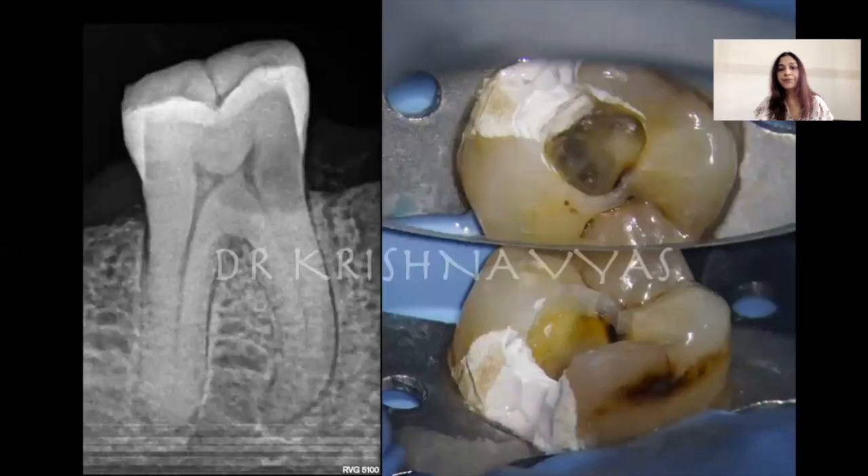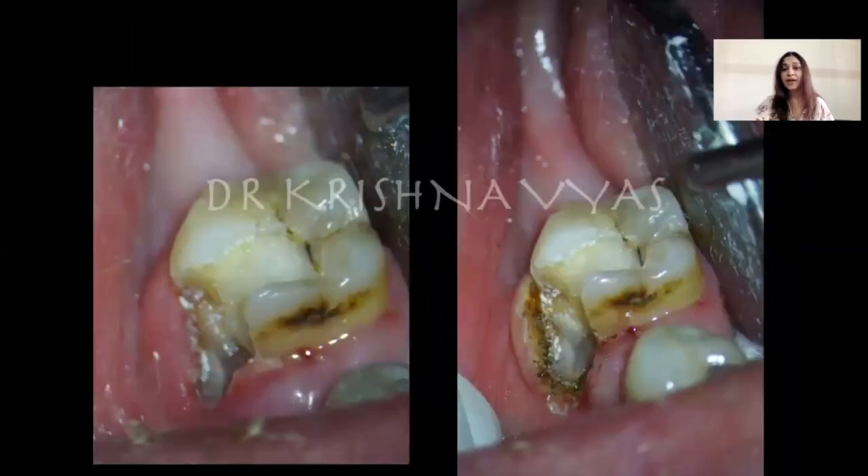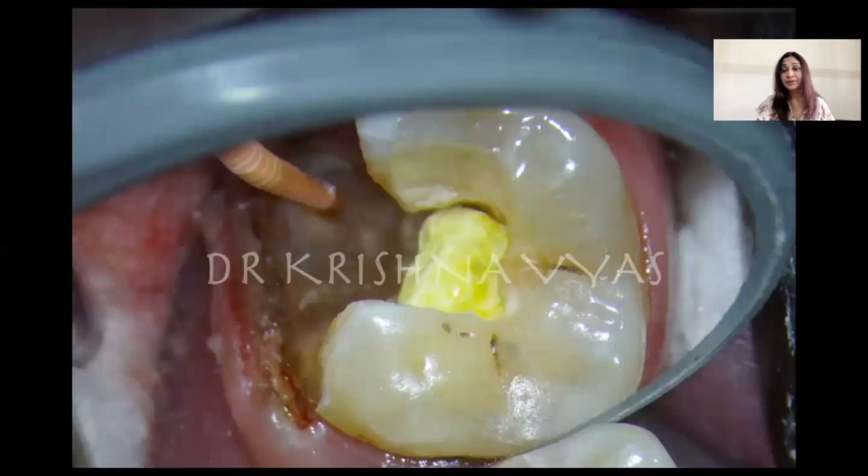Coming to the second scenario — very common in clinical practice — a Class V cavity extending subgingival with root caries. The patient had already lost two molars and did not want extraction. I did caries excavation and a quick temporary restoration, suspecting something unusual. After isolation, I could not trace the MB canal, so I removed the isolation and temporary cement and did deep margin exposition with a laser. Thereafter I found the canal orifice — it was on the root, at the extreme external surface. Doing a routine pre-endo buildup here would definitely block that orifice.